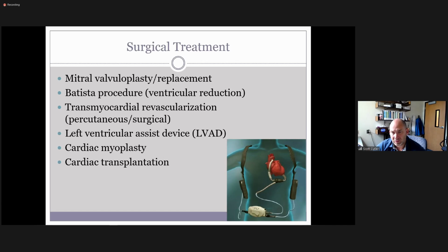Left ventricular assist device, those LVADs. As you can see in the picture there, that just shows what it is. Let me get the pointer here. So this goes right into the left ventricle. You'll actually see it go inside the ventricle when you're scanning. It's a big tube that comes in at the apex, comes down.